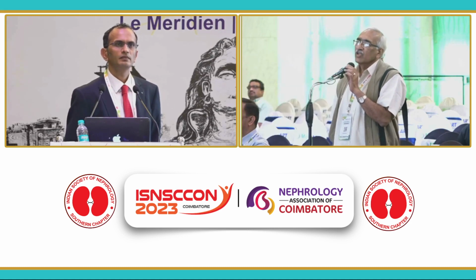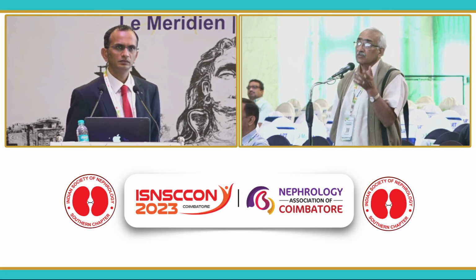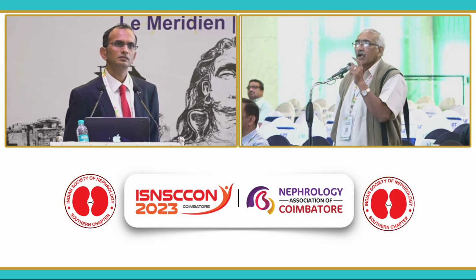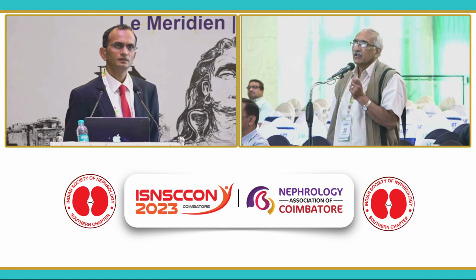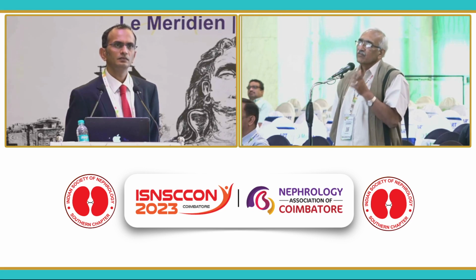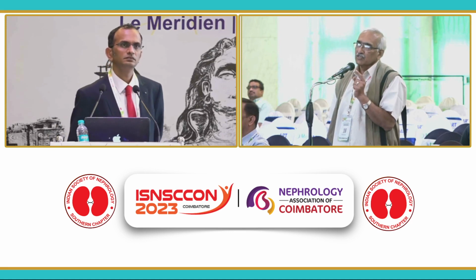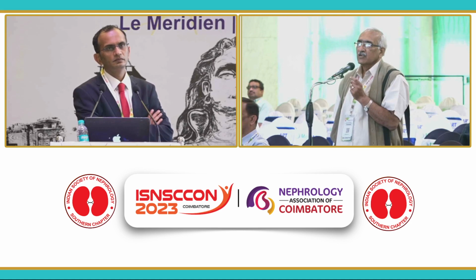So even such a minor injury from the shear flow of the blood is capable of producing minor changes on electron microscopy. I think this agitation of the membrane needs to be studied in vitro as far as what's happening to the membrane. That's one, because the microemboli are going to be dislodged, and what is the effect of that when it goes into the body.